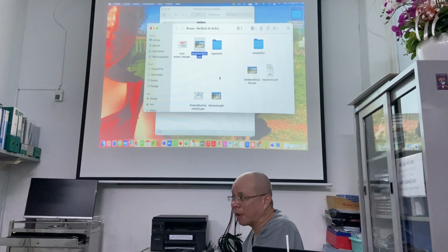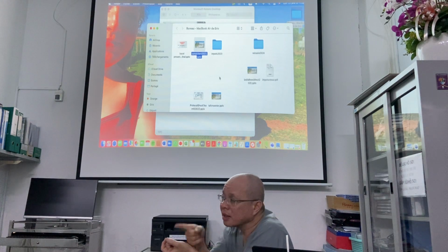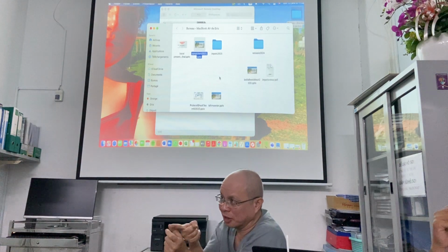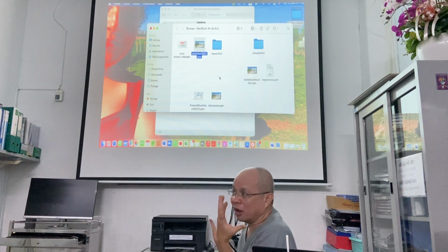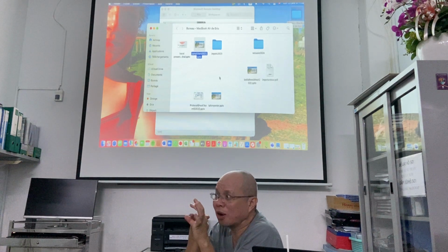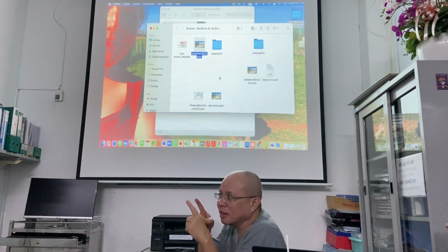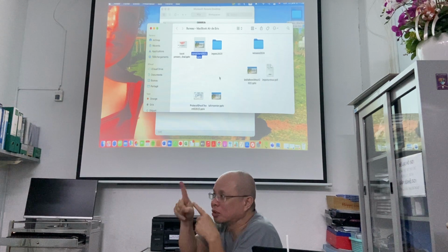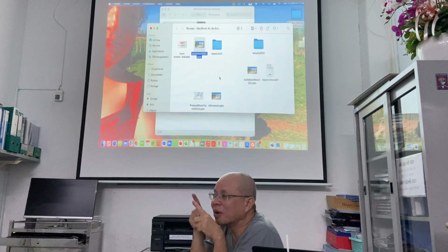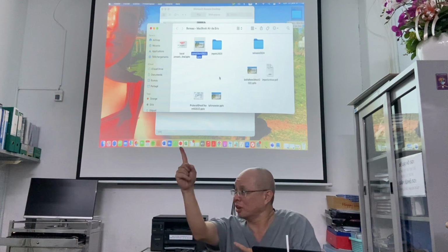But I don't know what happened, and then for the confirmation they injected contrast through the sheath. But oh my god, the sheath crossed the right ventricle, and the tip of the catheter crossed the septum, and now the tip of the catheter is in the left ventricle.